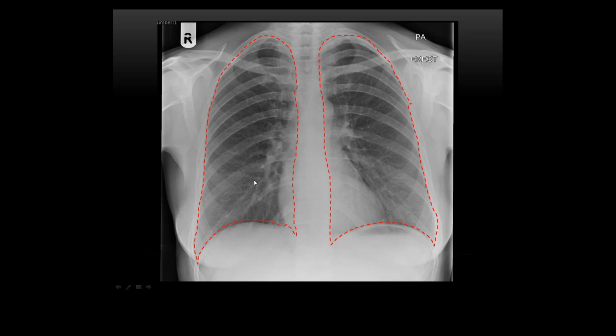It varies. It completely depends on our suspicion. So if we get a history that's looking like an inflammatory picture or an infected picture, then we'll do a follow-up chest x-ray, usually in 6 weeks. We tend to use a rule in radiology that the follow-up is 1 week per decade of life with a minimum of 6 weeks. That makes sense? So if the patient's 60, we do a follow-up in 6 weeks. If the patient's 80, we do a follow-up in 8 weeks. If the patient's 40, we'll do a follow-up in 6 weeks.